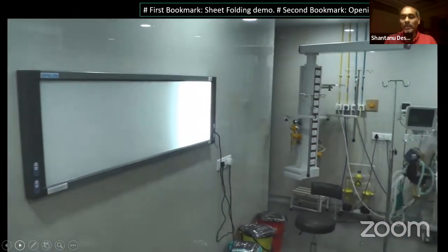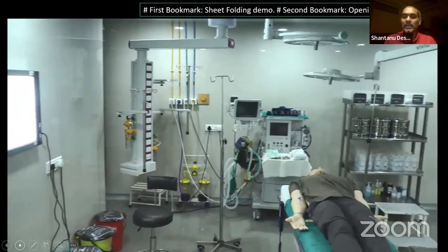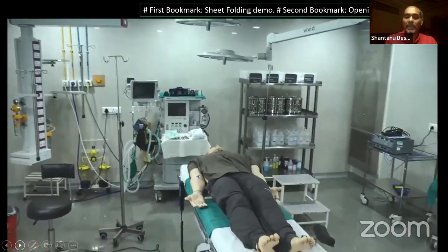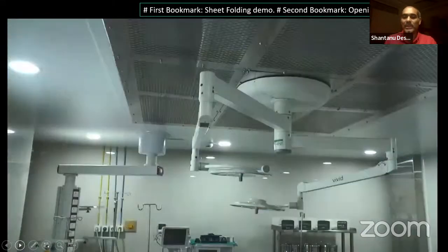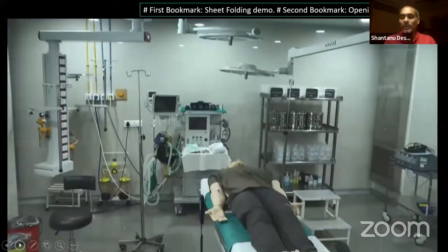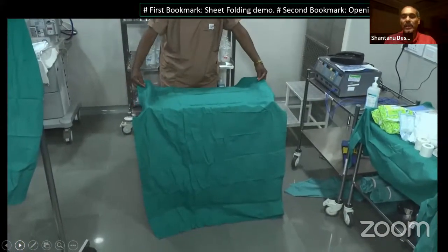As you know, the autoclave or the preparation for the OT begins a day prior. So that's the reason, once you plan, make sure all your draping and equipment, everything is sterilized in a proper way so that your draping works and the instruments that you need for your OT, everything is planned for you to get executed on the table.